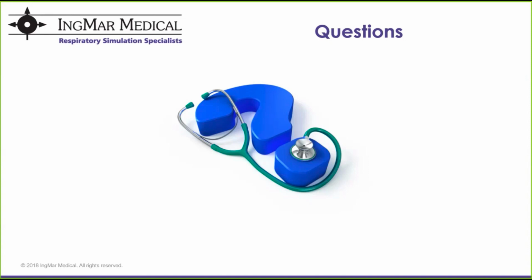Margaret asks, can the training be incorporated for a group of students, or is this an added cost?